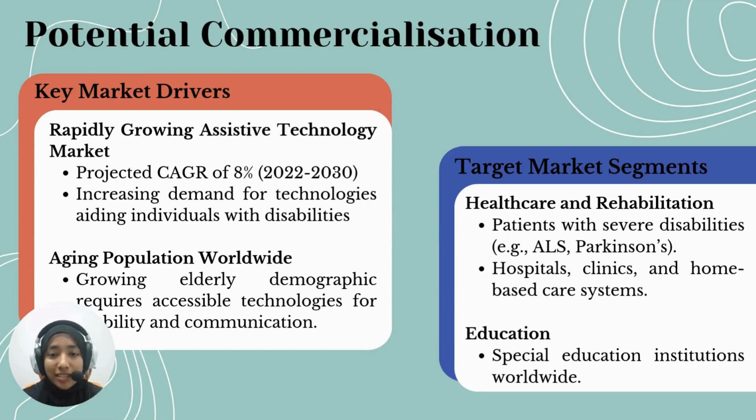The market for assistive technologies is expanding at a remarkable pace, with a projected compound annual growth rate of 8% between 2022 and 2030. The demand for solutions that support individuals with disabilities is skyrocketing. This rapid growth highlights the increasing need for innovative technologies that enhance independence and communication.